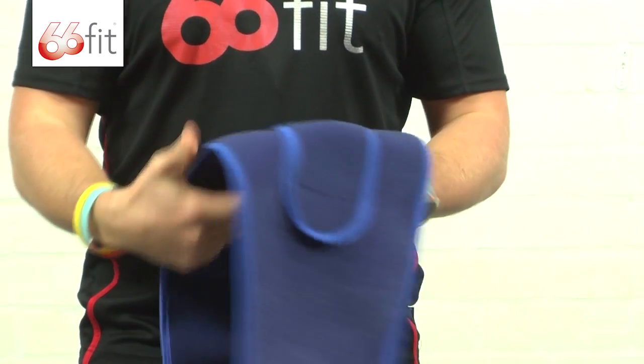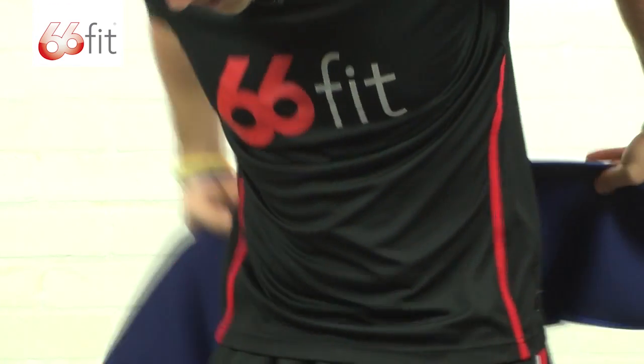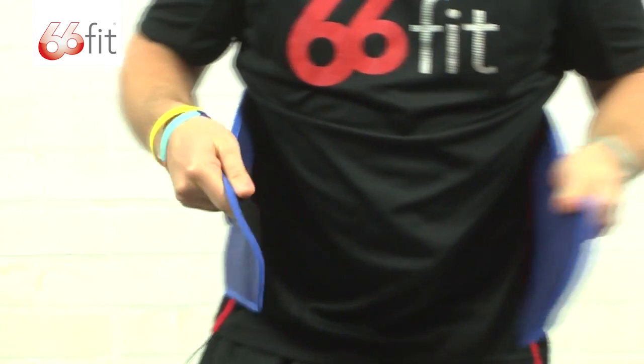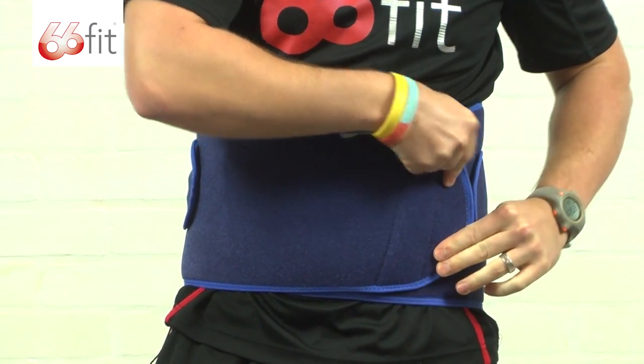Now to put on, it's really straightforward and really simple. Just literally wrap it around yourself like a belt, position it in the middle so it's just above your hips, wrap it around your tummy, pull it around and stick it in place.